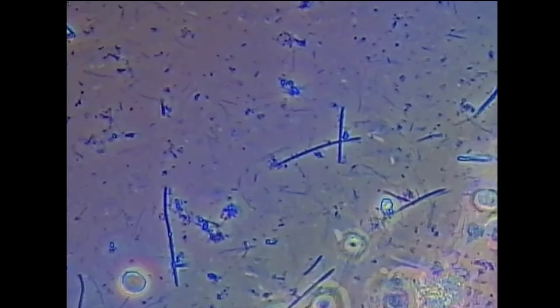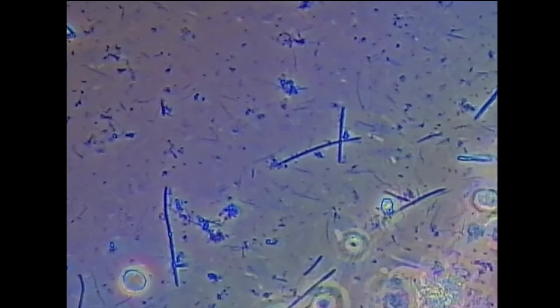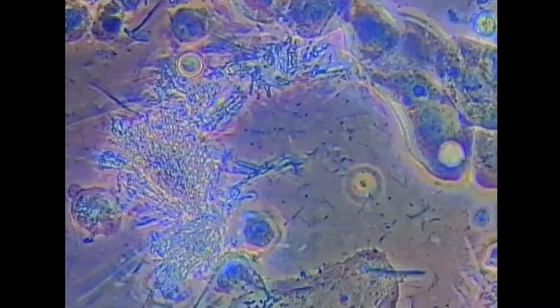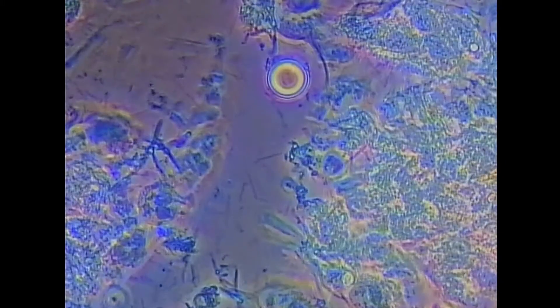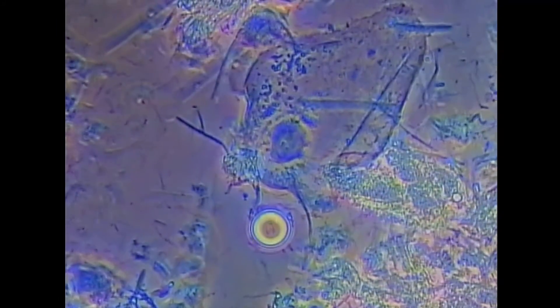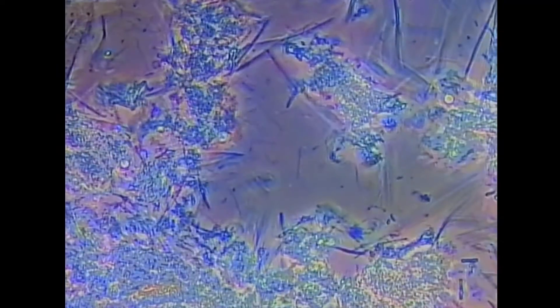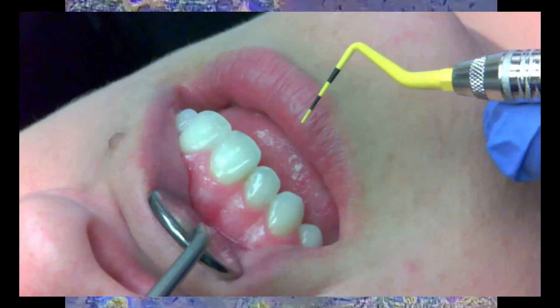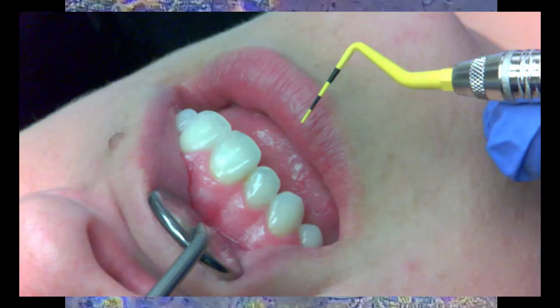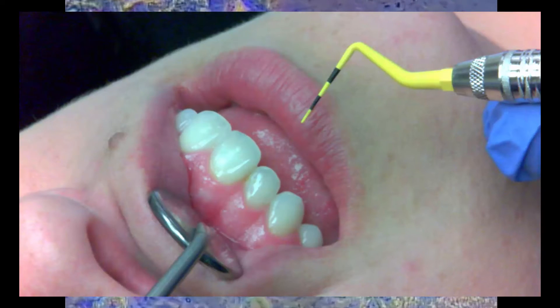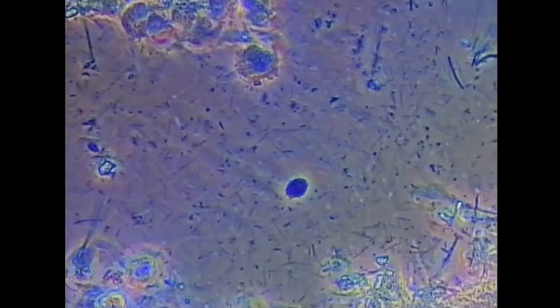As we pan around this slide, you have some epithelial cells here. You can see white blood cells trying to mount an immune response, but they're greatly outnumbered. The point of this video is: if all you're doing to assess periodontal risk is use a stick, the bottom line is you're going to be missing a lot of data.